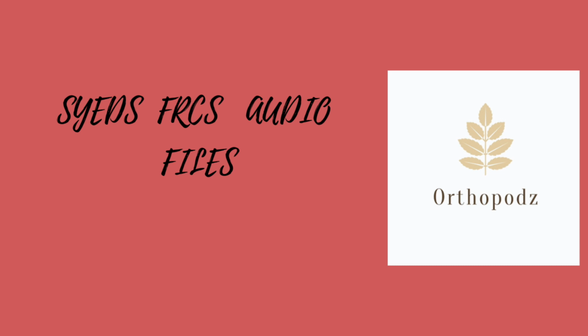Locking plate has an advantage because the threaded screw holes allow the screw to lock and act as a fixed angle plate. It acts as an internal external fixator, can be used for osteoporotic bones, can bridge a comminuted fracture, has better pull-off strength of the whole construct, and preserves blood supply. It sits off the bone, it is expensive, and cold welding is possible.